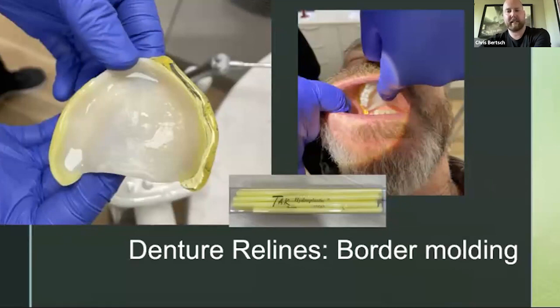And the nice thing with this too is that you can add onto it. With the green stuff we used in dental school, whenever you added, you could tell where you added. With this, it's very difficult to tell where you added, and it's a seamless transition all the way around. So it's a lot more user-friendly, easier to use, and quicker too.